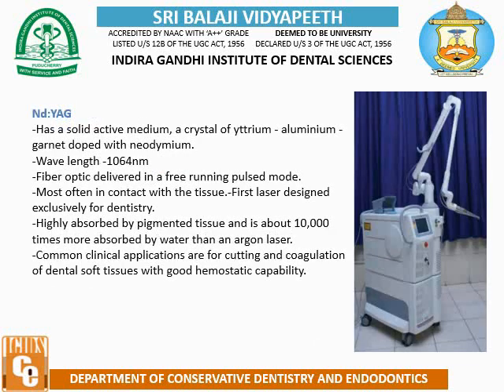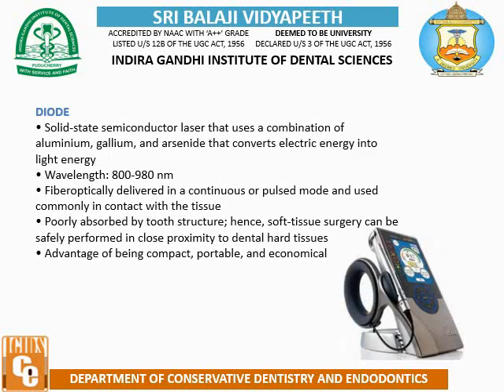Nd:YAG has a solid active medium, a crystal of yttrium aluminum garnet doped with neodymium. Wavelength 1064 nanometer. Fiber optic delivered in a free running pulsed mode, most often in contact with the tissue. First laser designed exclusively for dentistry. Highly absorbed by pigmented tissue and is about 10,000 times more absorbed by water than an argon laser. Common clinical applications are cutting and coagulation of dental soft tissue with a good hemostatic capability.